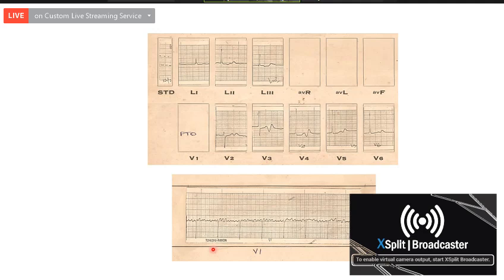So a full diagnosis: the patient is having atrial fibrillation, complete heart block, LVH by electrocardiogram criteria, and prominent U waves. Prominent U waves indicate hypokalemia, and the LVH may indicate mitral regurgitation. Atrial fibrillation and complete heart block are also due to digitalis toxicity, a digitalis side effect. So the full diagnosis would be atrial fibrillation, complete heart block, LVH, hypokalemia, probably digitalis toxicity. Most likely there is digitalis toxicity.